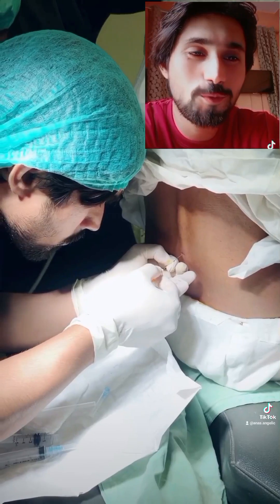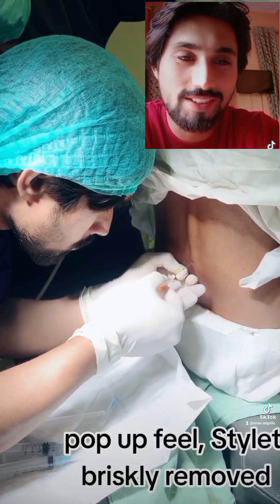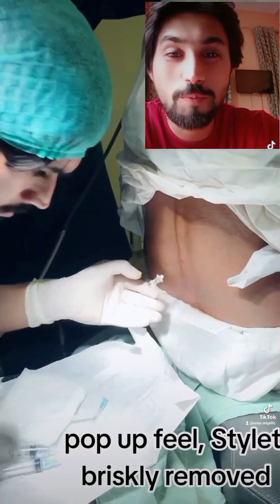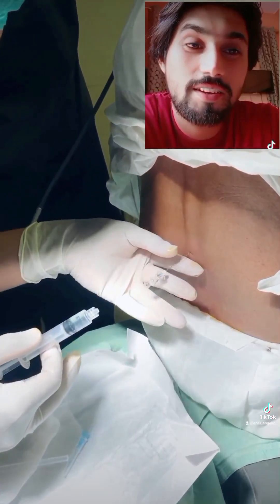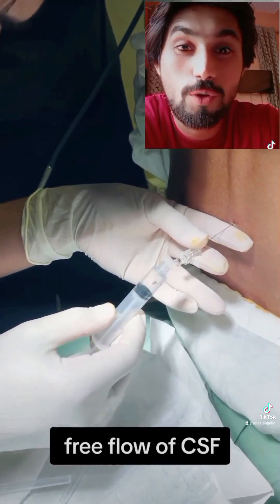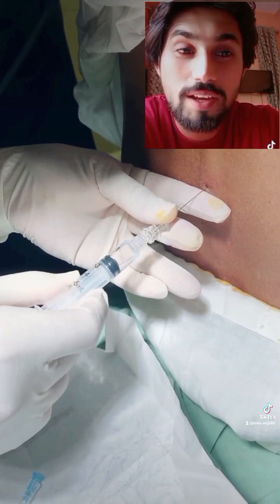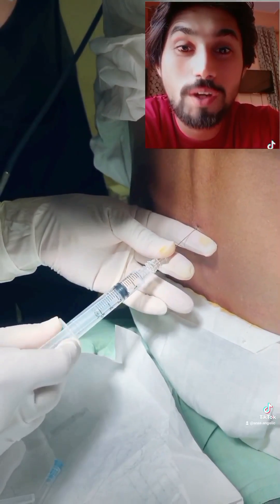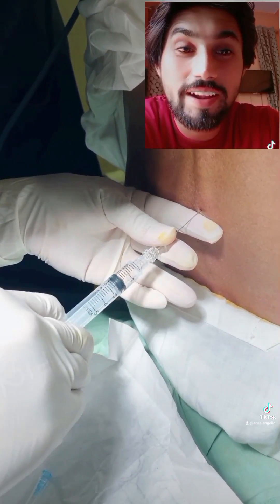Yes, you can see the pop sensation — now briefly remove the stylet. You can notice the free flow of CSF. Here it is very important to firmly support the needle with the other hand.